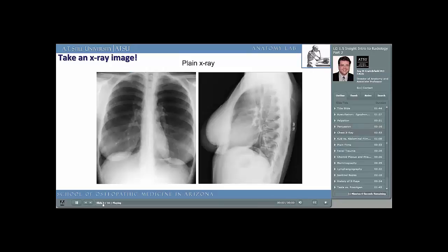After we have exhausted all the techniques used by our own senses, i.e. inspection, auscultation, palpation, and percussion, now we begin to use radiological techniques available to us, beginning from the simple to the most complex. Perhaps the simplest radiological intervention is a plain chest x-ray.